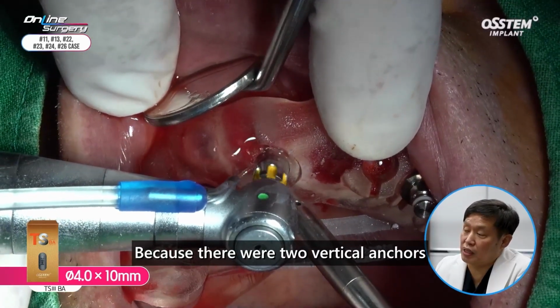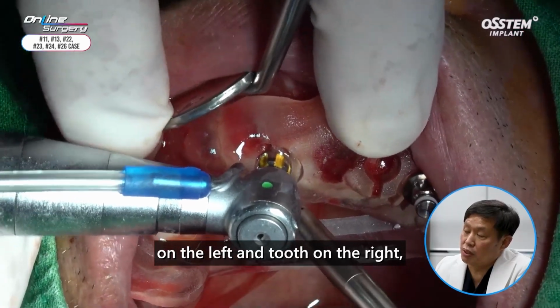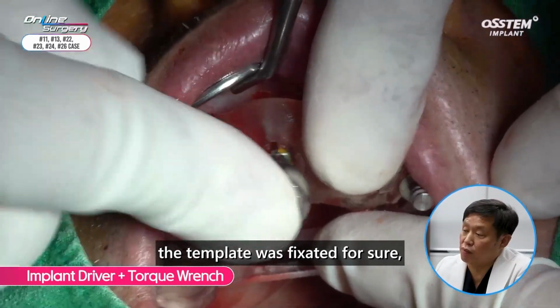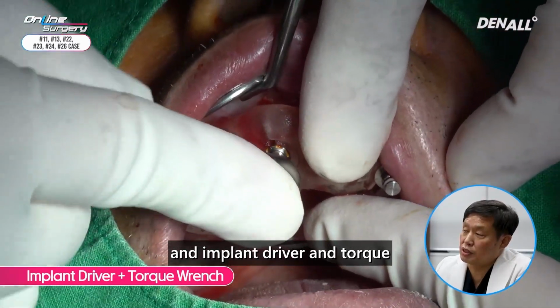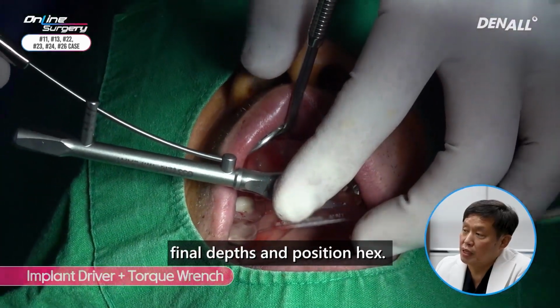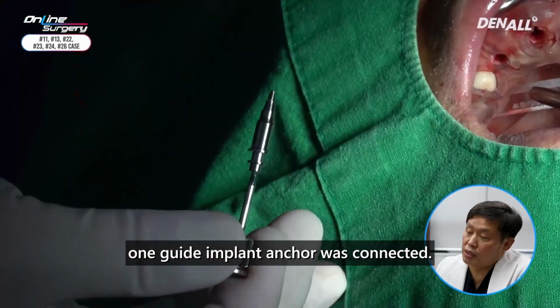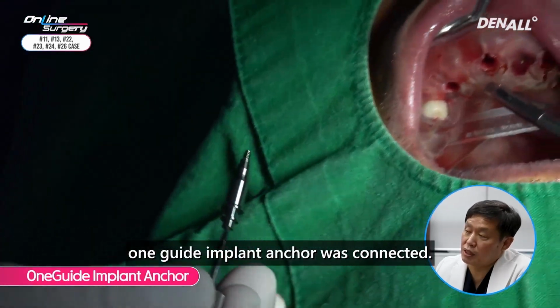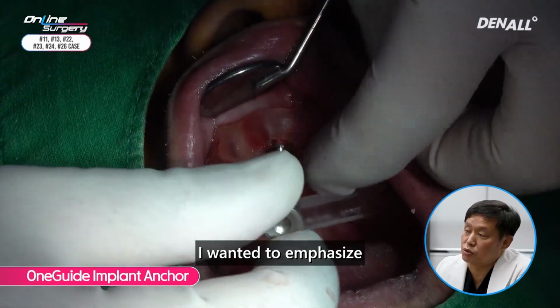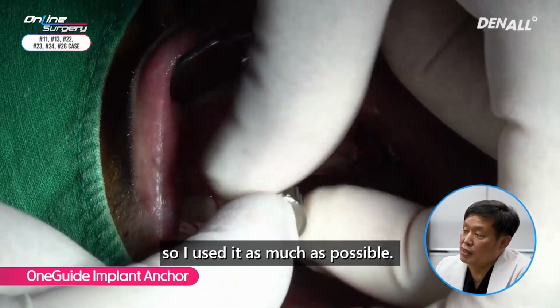Because there were 2 vertical anchors on the left and a tooth on the right, the template was fixated for sure, and implant driver and torque wrench was used to adjust the final depths and position hex. Primary stability was sufficient. In number 11, OneGuide implant anchor was connected. In this clip, I wanted to emphasize the use of vertical anchors, so I used it as much as possible.